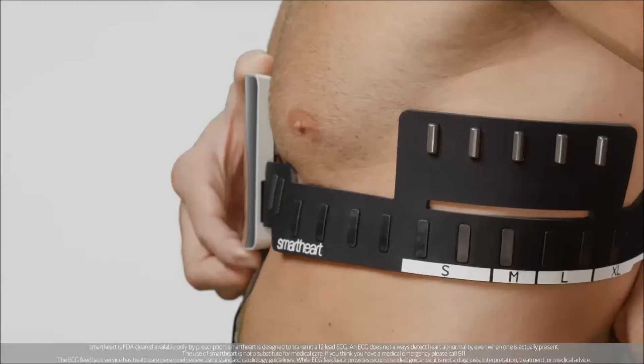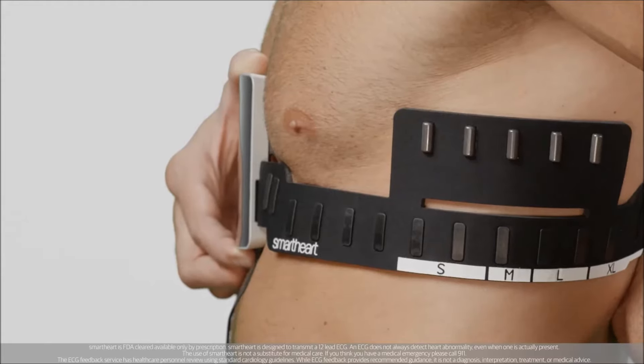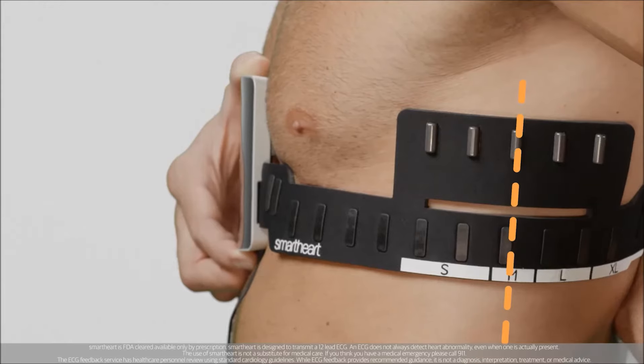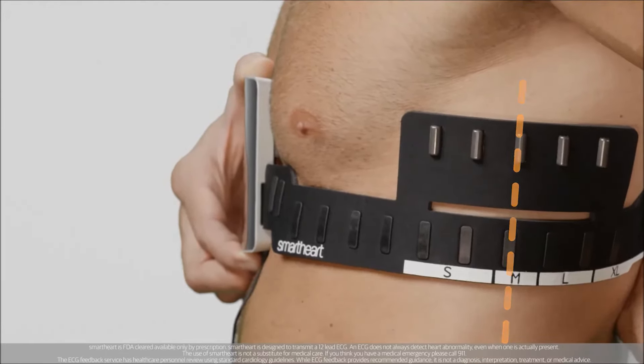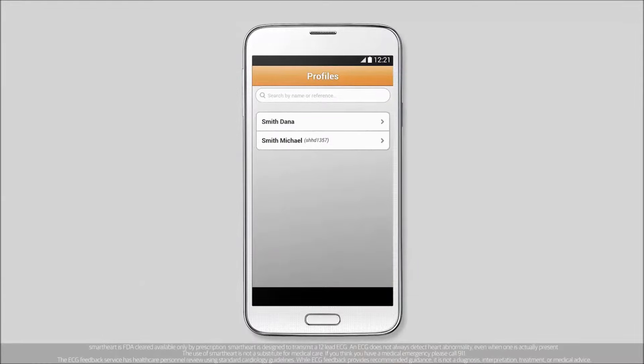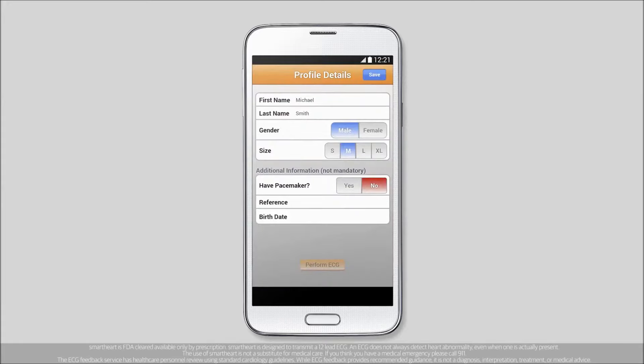If this is the first time using the device, select your size. Select from one of four preset sizes by drawing an imaginary line between the left armpit and hip bone. You'll add the selected size to your app profile later. Make sure you're using the correct profile when you enter size information into your SmartHeart app. You can enter up to two profiles per household.